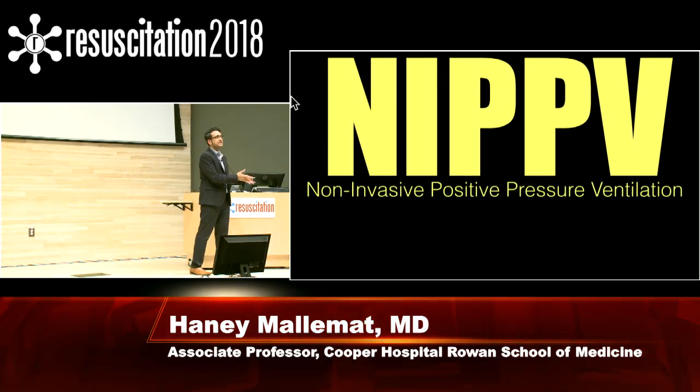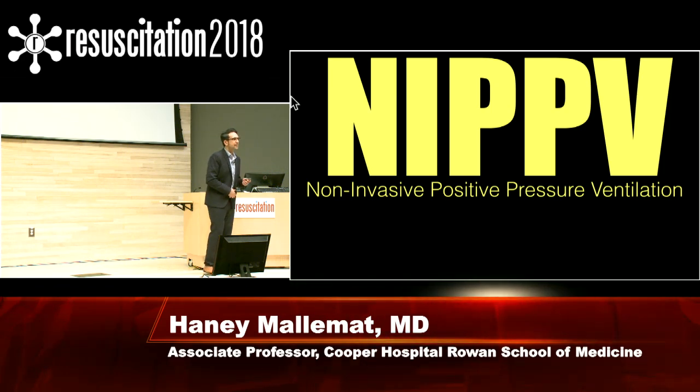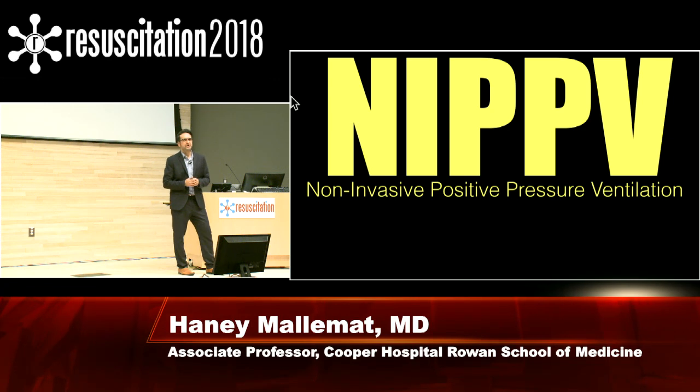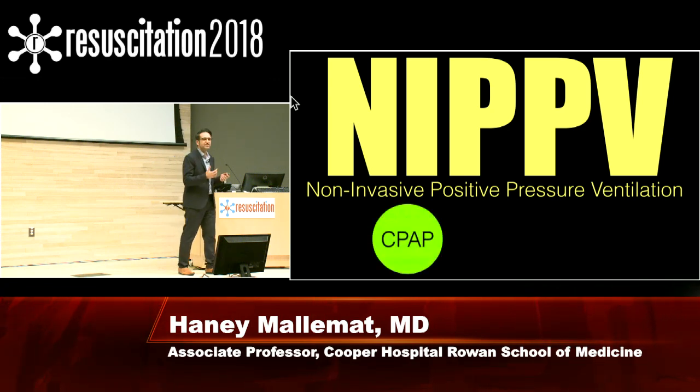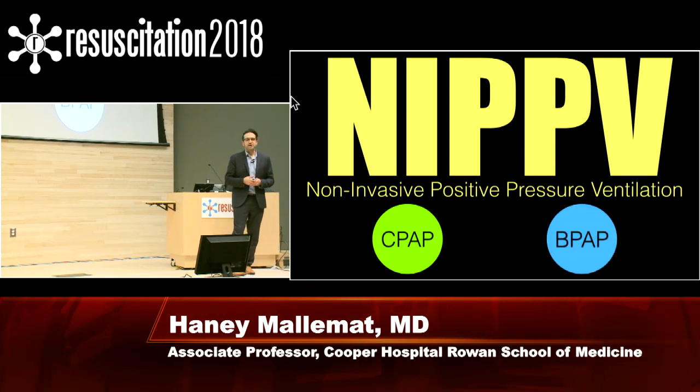So if you understand non-invasive, invasive should be relatively similar. So how many different types of non-invasive ventilation are there? Two. You can either do continuous positive airway pressure or bilevel positive airway pressure.